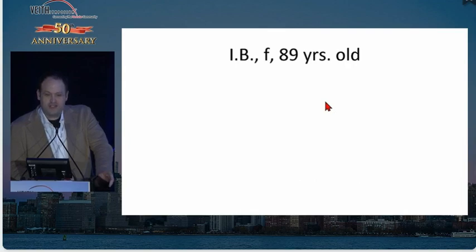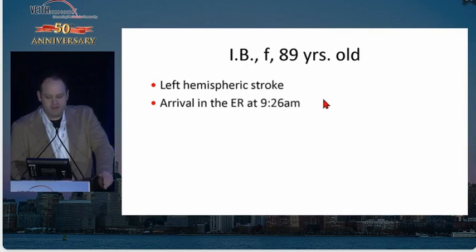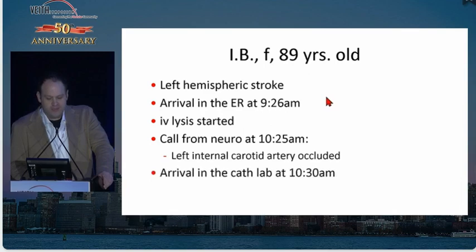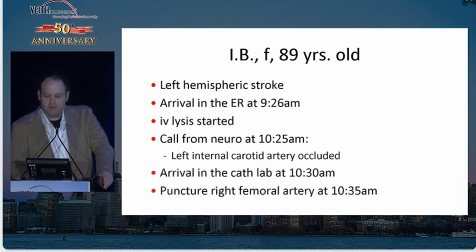So the patient I want to show is a female patient, 89 years old, who had a left hemispheric stroke and arrived at the ER at 9:26. IV lysis was started. The call from the neurologist came at 10:25 a.m. The left internal carotid artery was occluded, and the arrival at the cath lab was at 10:30 a.m. and the puncture of the right femoral artery at 10:35 a.m.